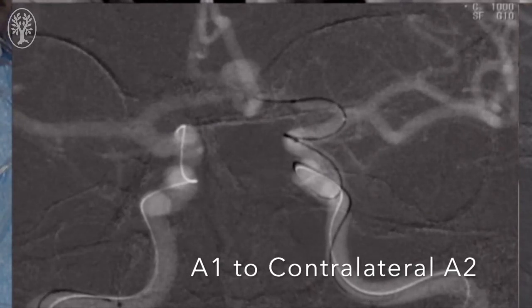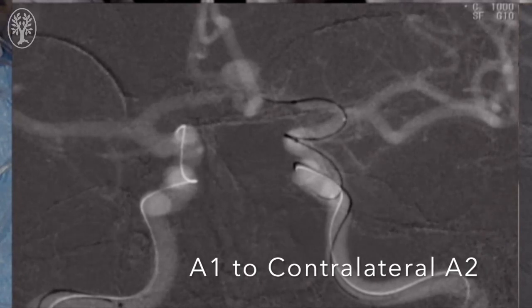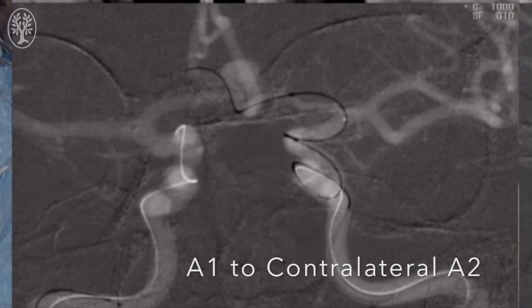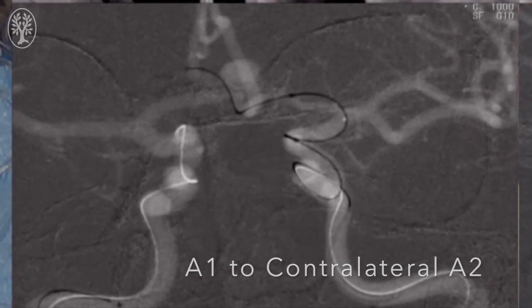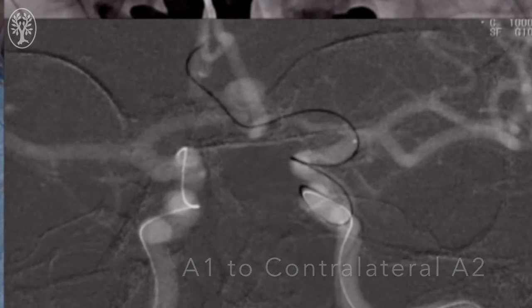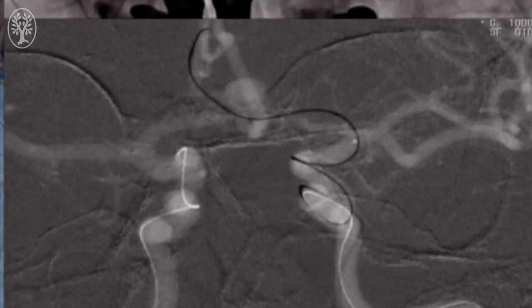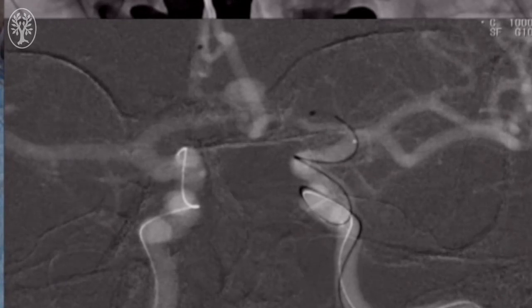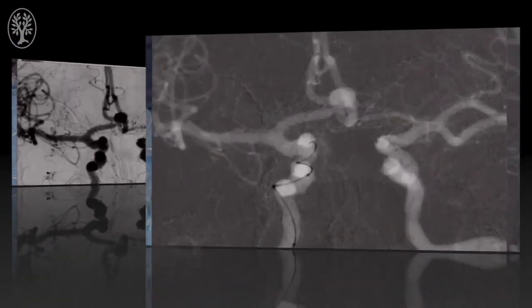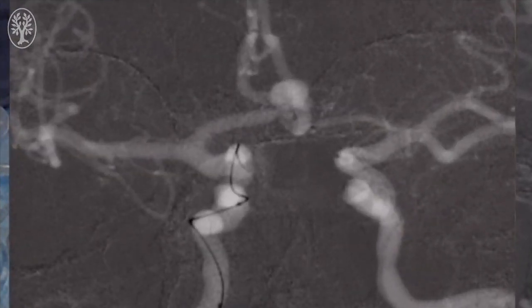Once we have firm purchase in the A1 segment, the wire then is navigated across the anterior communicating artery into the contralateral A2 segment and up the A2 segment of the right anterior cerebral artery. Here we can see very distal purchase of the microcatheter. Next, we come back from the right side and we're going to attempt to access the aneurysm.